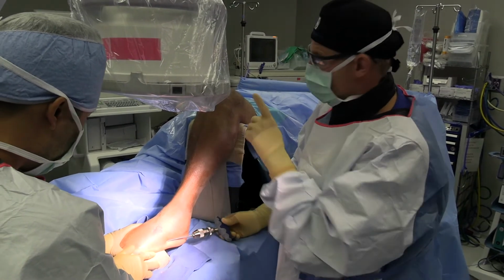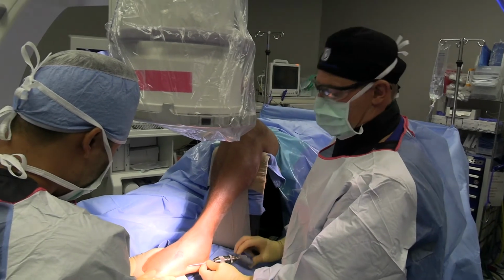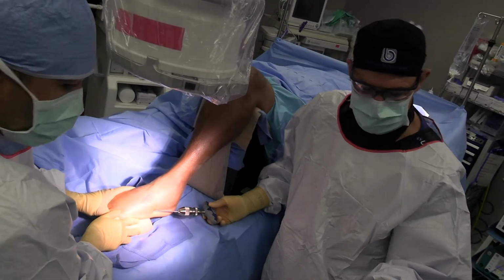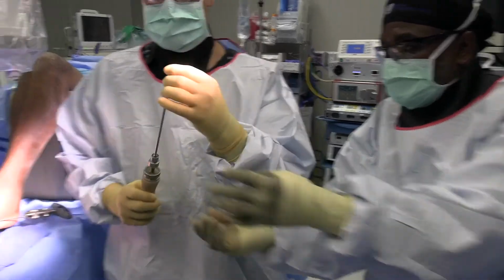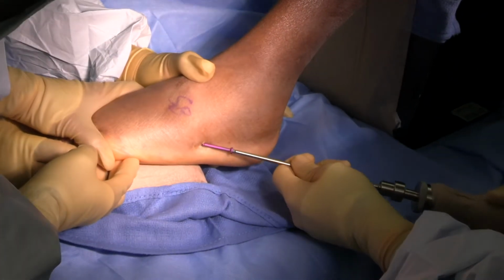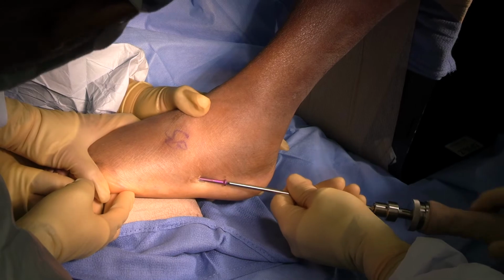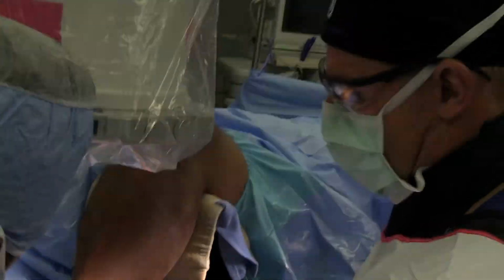I can see the drill bit is making its way down the center of the metatarsal, so I know I'm in perfect position. This is basically reaming the endosteal bone and creating bone graft to go across the fracture site. Now, let me have the screw. So this is a compression screw, and the soft tissue leads me right to the hole. You see the tip of the screw is falling in that hole, and then I just start screwing it in. The threads have to be past the fracture in order to get compression.